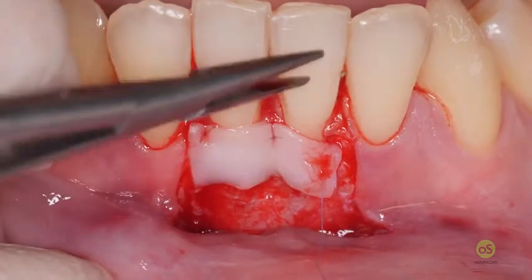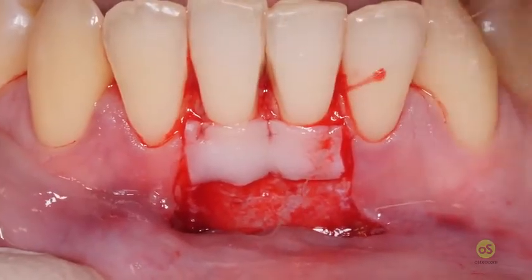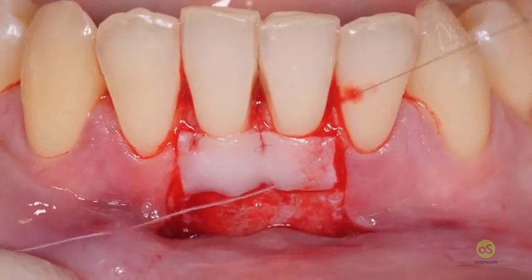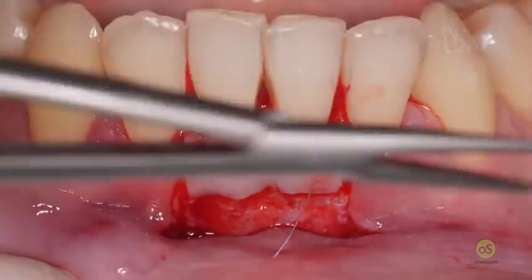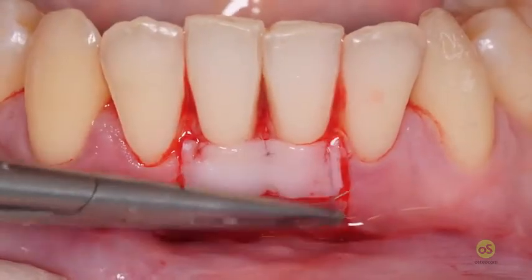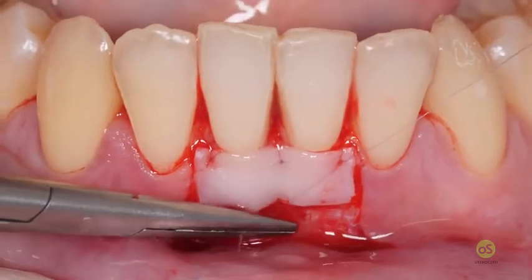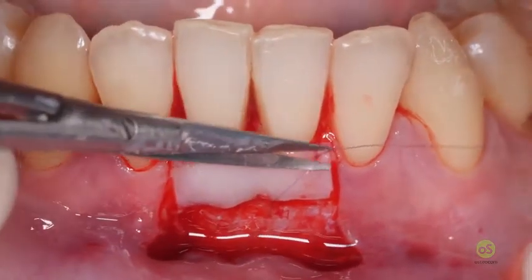I was not happy about the positioning of the graft in this area, and so I want to do it again. It should be really stretched. Now I like it.